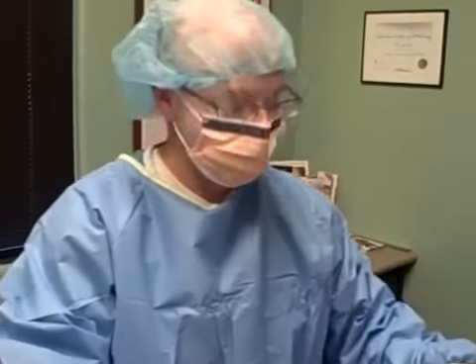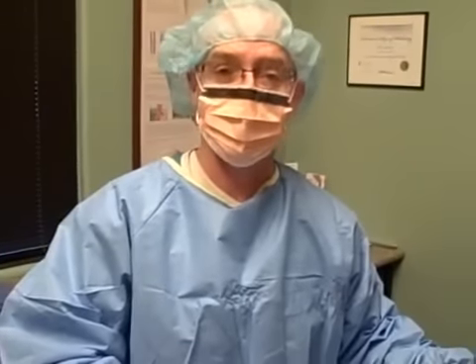We wanted to show you what an ambulatory phlebectomy looks like. This patient has already had radio frequency ablation on the greater saphenous and small saphenous veins, and sometimes after you do that you still have those bulging varicosities that a lot of patients don't like. They don't feel like they can go out in public with shorts on because they have these — looks like snakes on their legs. The way you get that really nice cosmetic look is to do what we call an ambulatory phlebectomy.